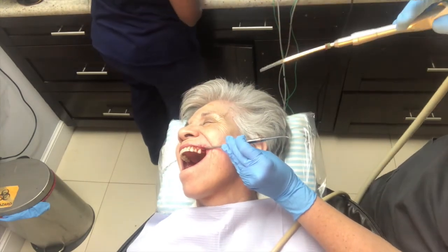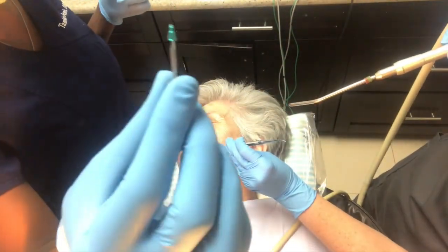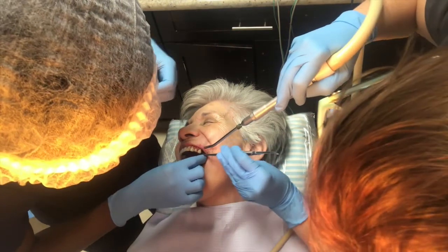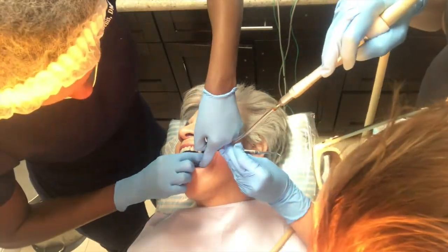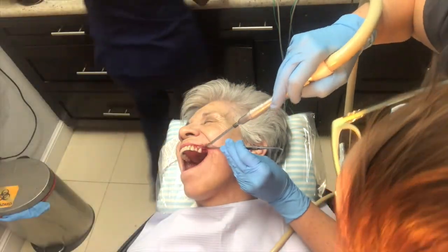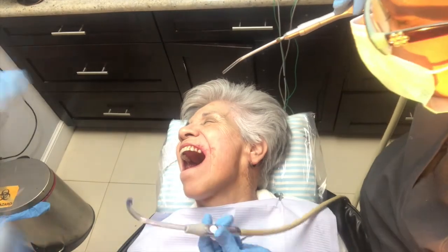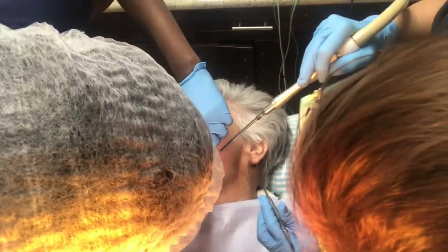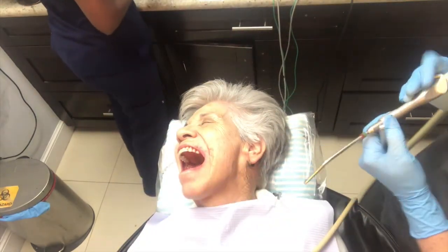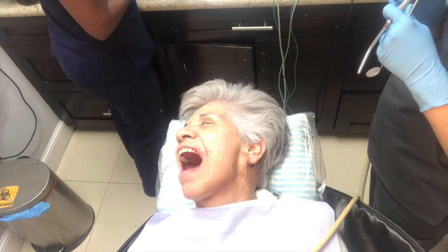So I'm at the counter, and what I'm doing now is unpackaging the healing cap. That's it right there, that green little thing. It is a short screw that goes into the top of the implant well, so that when the implant is healing, nothing can get into the little hole. That hole is actually going to be our access point to later screw in the abutment, which is going to hold up our future crown.